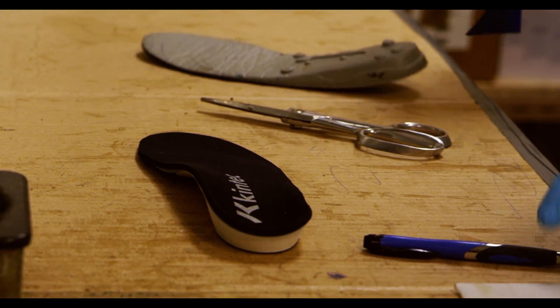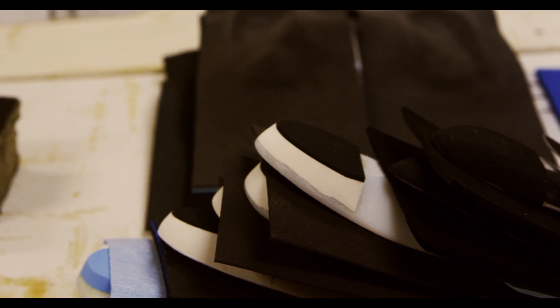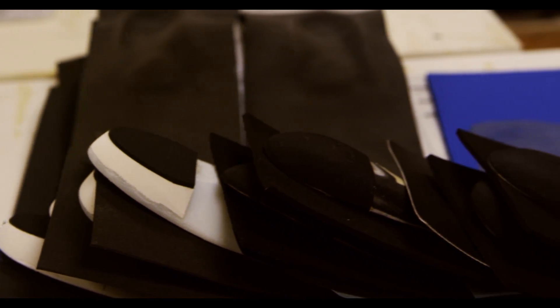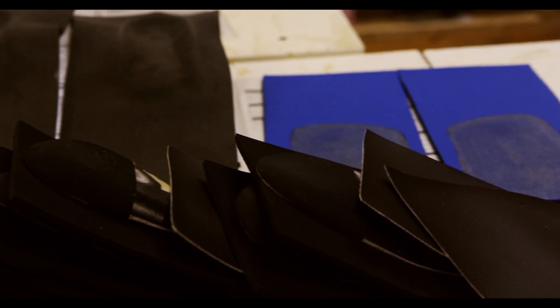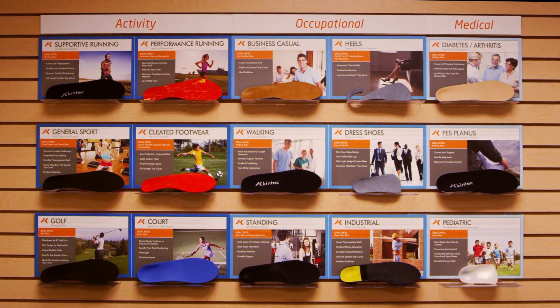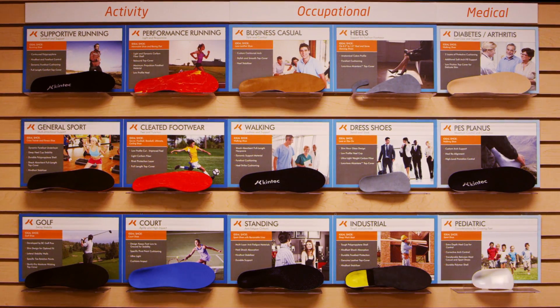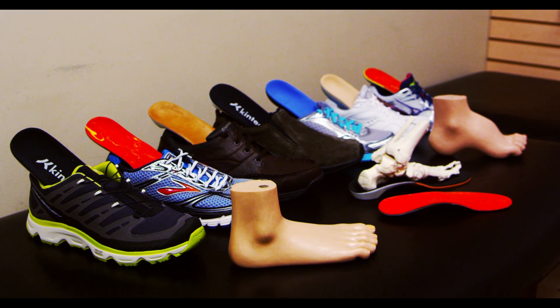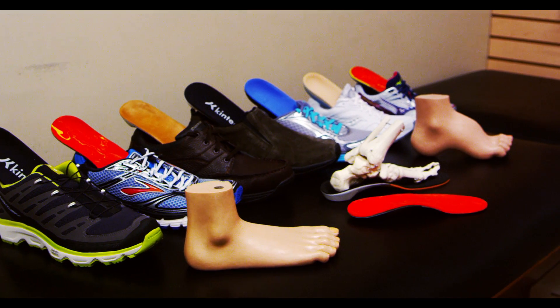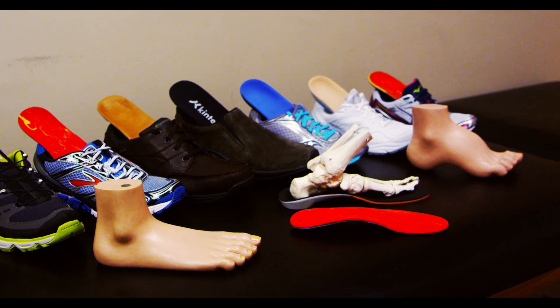Before leaving the lab, every orthotic is carefully checked to ensure that it matches our stringent quality standards and its specifications match the order in every detail. As we have now shown, a lot of hard work and many experts' hands are involved in creating custom foot orthotics that are personalized for you and your unique biomechanics. And now you know why a deceivingly simple looking orthotic is actually a lot more complicated than it appears.